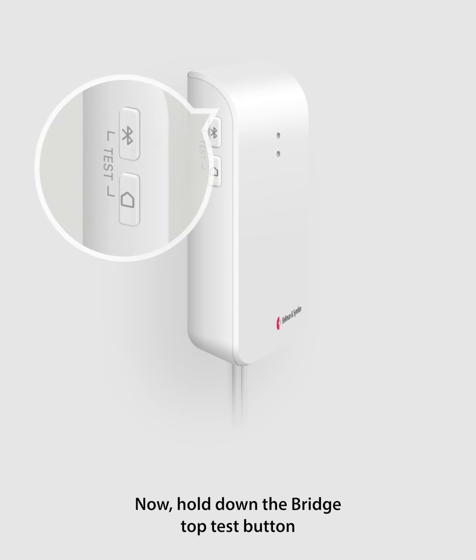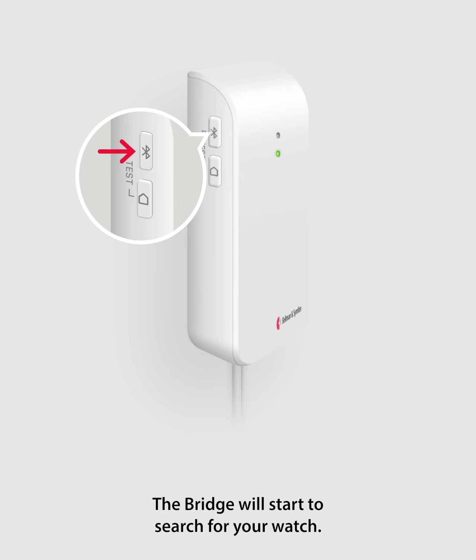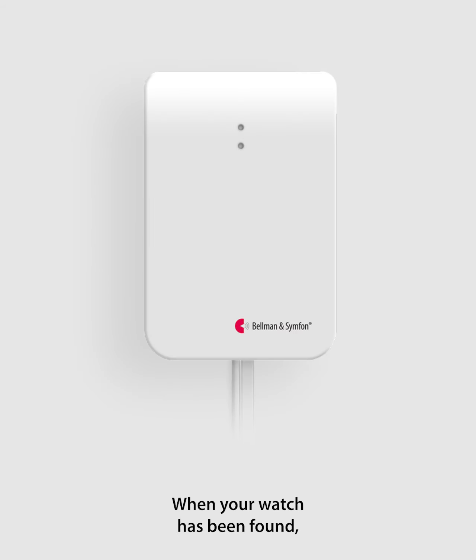Now hold down the bridge top test button until the front LEDs start to blink. The bridge will start to search for your watch. When your watch has been found, the bridge lights up the top LED in blue.